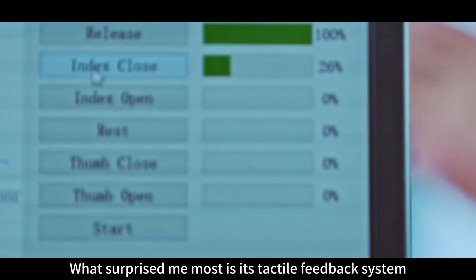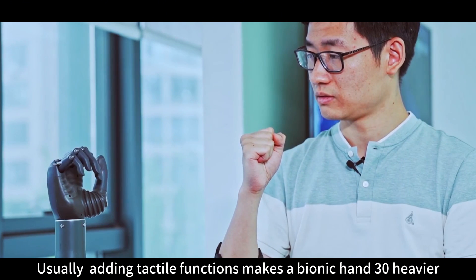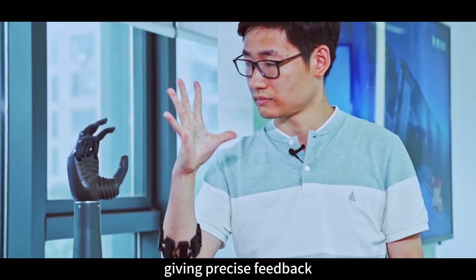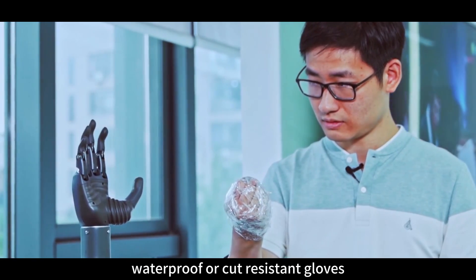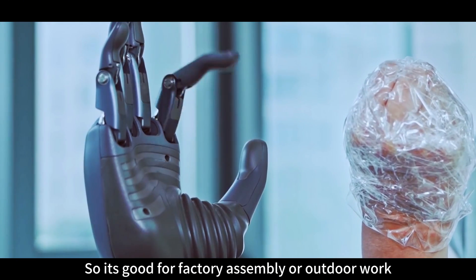What surprised me most is its tactile feedback system. Usually, adding tactile functions makes a bionic hand 30% heavier. But Revo 2 uses integrated tech to keep the weight the same while still giving precise feedback. It can feel the texture of fabric, tell how hard or soft an object is, and even sense how close something is. Even better, it works with regular waterproof or cut-resistant gloves, and the tactile feedback still works — making it great for factory assembly or outdoor work.